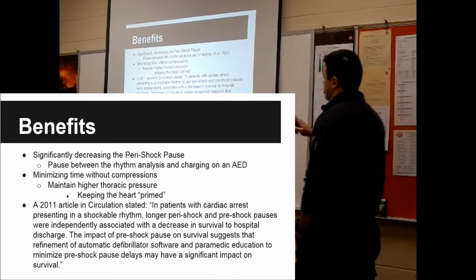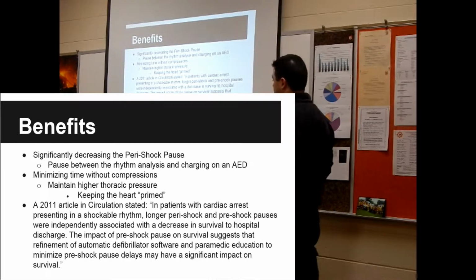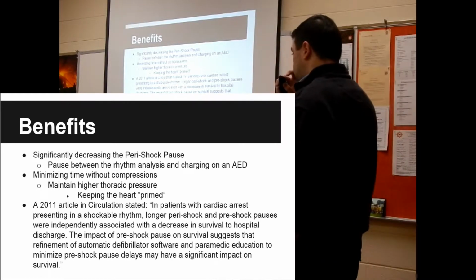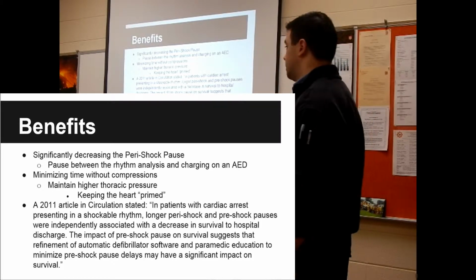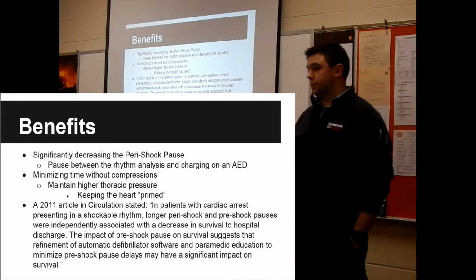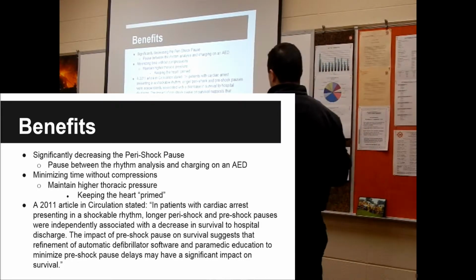Just in this article that was released by Circulation, the impact of pre-shock pause on survival suggests that refinement of automatic defib software and paramedic education to minimize pre-shock pause delays may have significant impact on survival. It's proven that time off the chest and the time that you delay is hurting your patient. So they want it to be at the paramedic education. We're dropping it down to the BLS, which, like Matt said, is in the BLS scope of practice with proper training and medical director approval, which we have obtained from Dr.